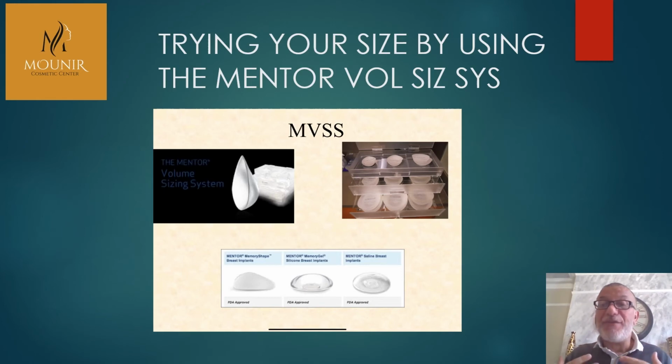And it's better to take a photo with the whole body in profile, to see the balance between the upper and the lower body. Let me say this, even if it sounds strange: if someone has a really flat backside, flat bum, and you put in a full implant, it will look out of proportion. If someone has a more curvy body, then when you put the implant in, it looks more balanced. This is why it's really important to take photos while you try the implant, so you can remember what it looked like when you leave the clinic, when you leave the consultation.